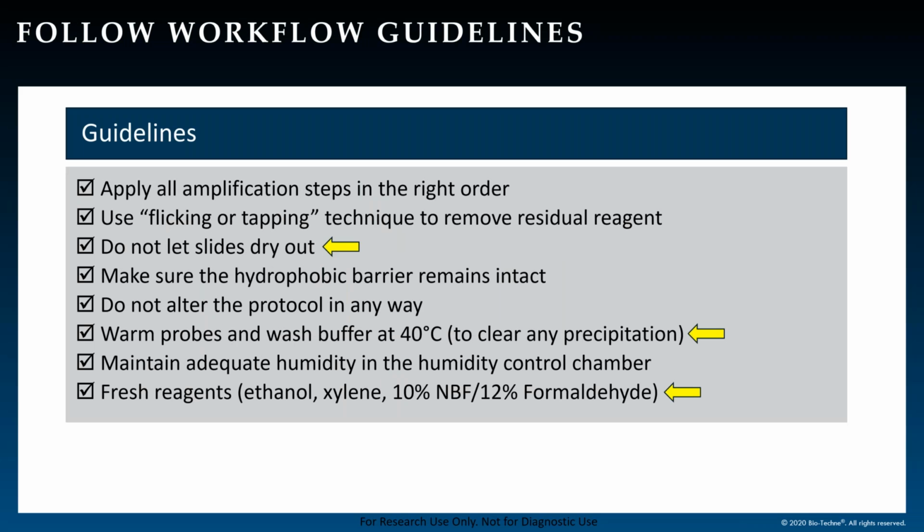We also have recommended general guidelines, such as once you begin the assay, do not let the slides dry out. Warm probes and wash buffer at 40 degrees if any precipitation is present, and use fresh reagents like 10% NBF or 12% formaldehyde, which is needed for the post-fix step.